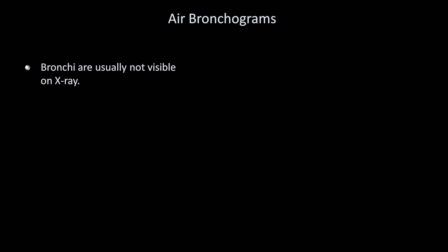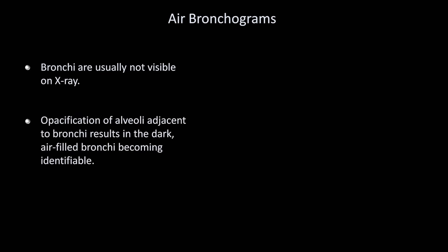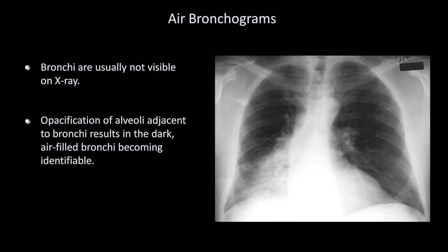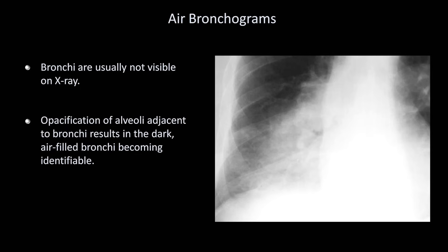First up are air bronchograms. Since bronchi are relatively thin-walled air-filled structures surrounded by air-filled alveoli, they are usually not visible on x-ray. However, opacification of alveoli adjacent to a bronchus results in the dark air-filled bronchi becoming identifiable against a white background. In this example, the patient has opacification of the right lower lung zone, probably the right middle lobe. If we zoom in on the opacification, we can see an outline of a dark branching structure which are the bronchi.